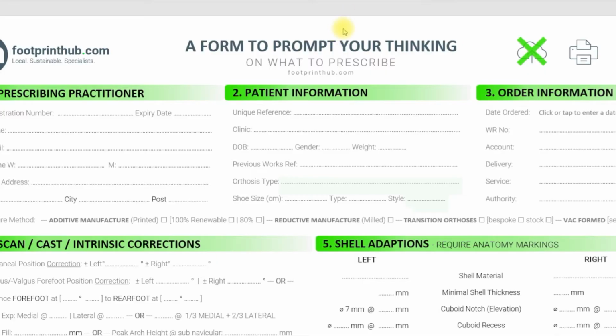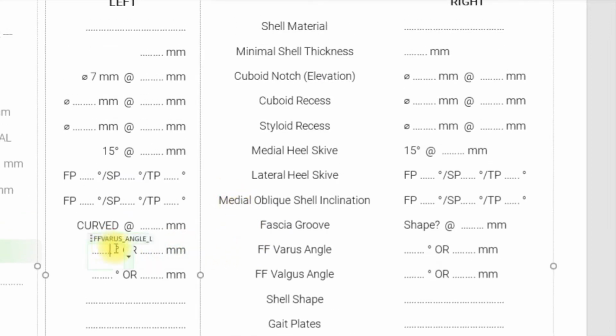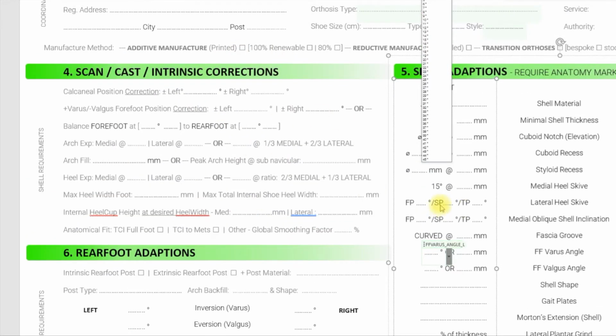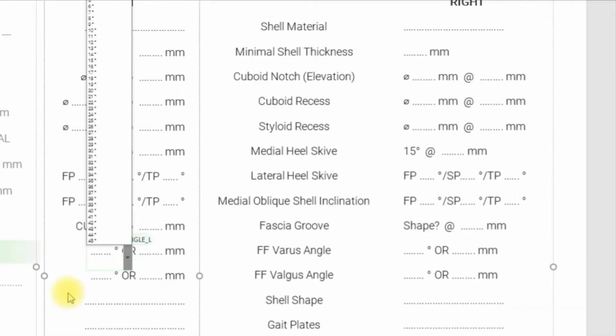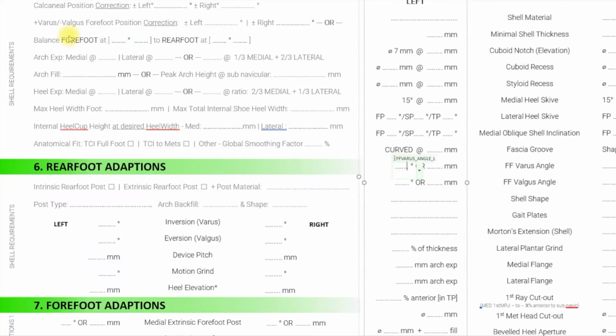Welcome to 5.10. Here we're looking at the forefoot Varus angle. So this relates to the degrees that you want to see the angle after we've adjusted it for the intrinsic cast corrections. So you may have adjusted it here at the balance of forefoot to the rear foot at 0. Remember, if you want any additionals or movement from there, it can confound those two sections there.